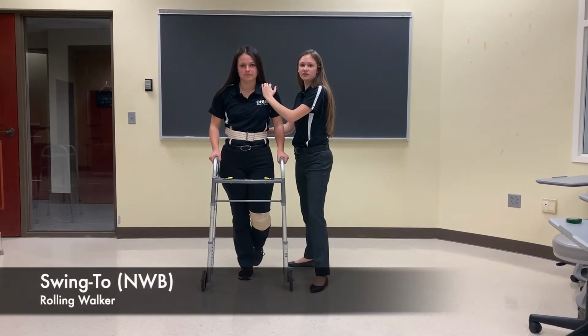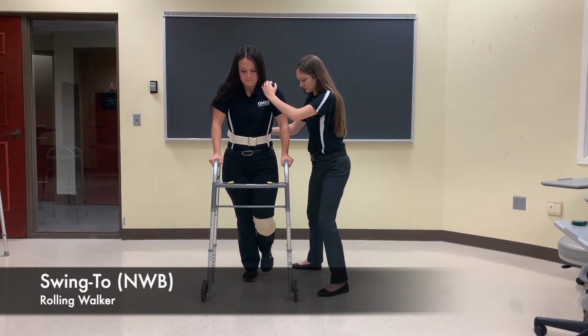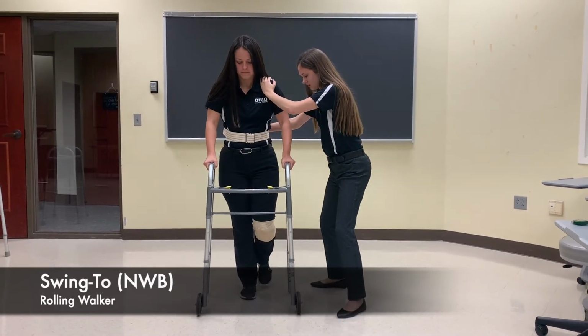This is a swing-to gait pattern. Walker, push, walker, push.